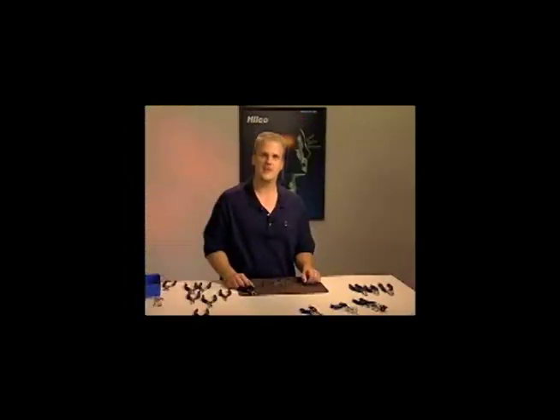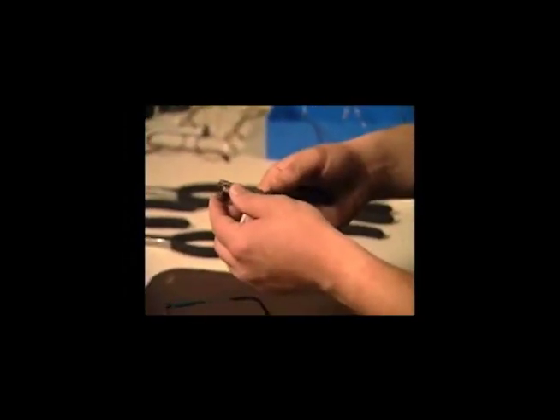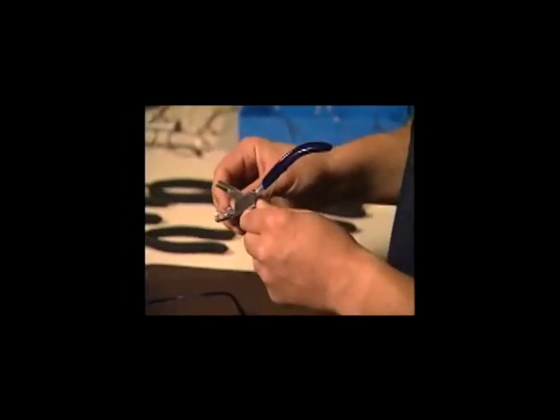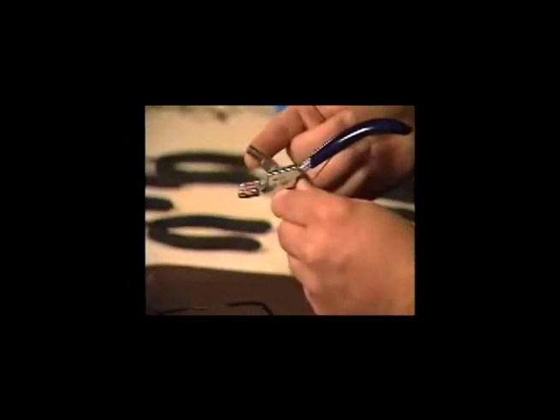If there's a need to decrease the bridge length or the distance between the lenses, you can do that using a shaper plier — which we used earlier to aid in bending the skull bend and mastoid bend. But this plier was actually designed to reduce the DBL of frames. It's designed with two protective non-marking pins that you place on the frame front in the round jaw to reduce the gap between the lenses.